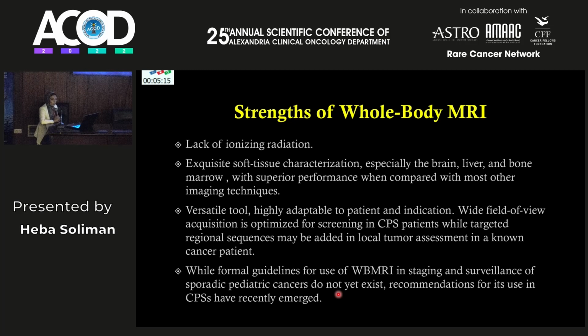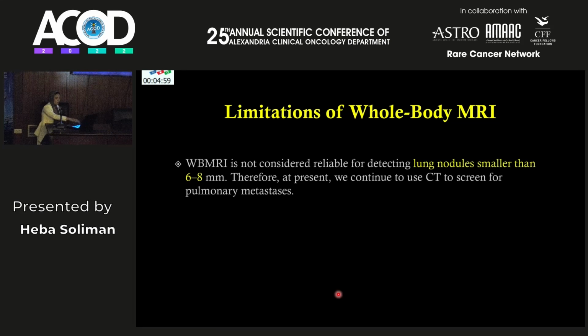While formal guidelines for the use of whole body MRI in staging and surveillance of pediatric cancer patients do not yet exist, recommendations for its use in cancer predisposition syndromes have recently emerged.